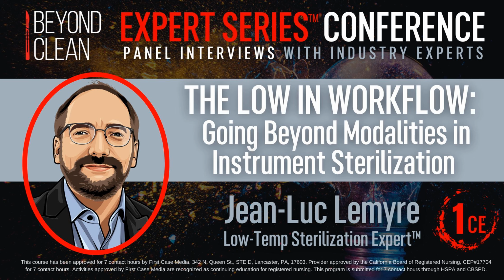If you've got cellulosic material in it, it tends to absorb a lot of the peroxide. So I think you've got two risks there. It can remove peroxide that should be available for sterilization efficacy, and then it gets absorbed in the cellulosic material. If it absorbs too much, your cellulosic material is at risk of, you'll get burned touching it out of the sterilizer. Right, yeah.